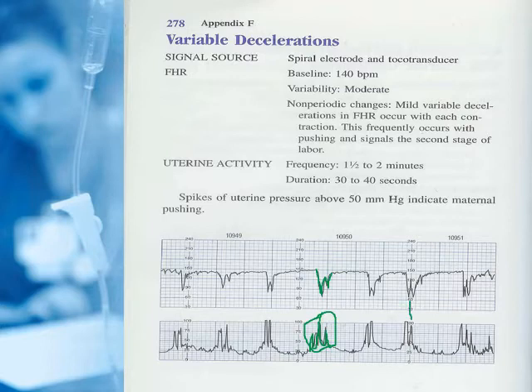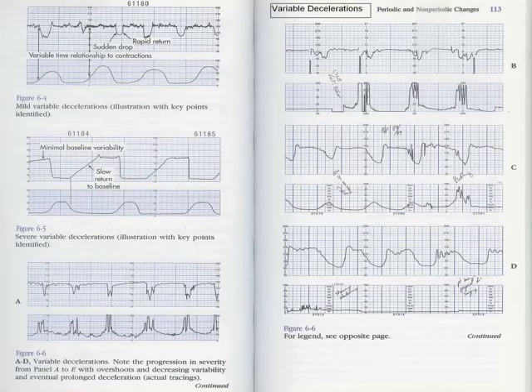So if delivery is fairly imminent, we don't worry about these. These are very normal at this point in labor. We don't ignore them, but we don't have to do anything when she's pushing, as they're obviously a direct result of her pushing and increasing that pressure really high.